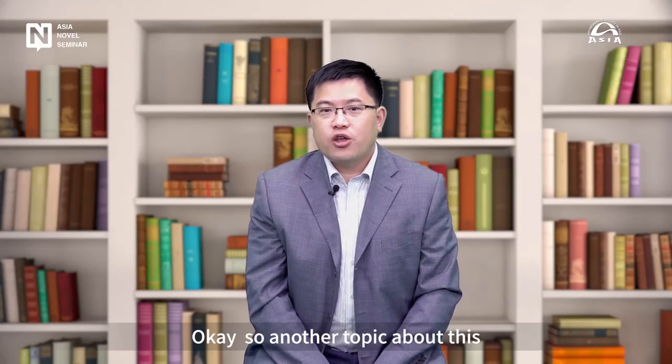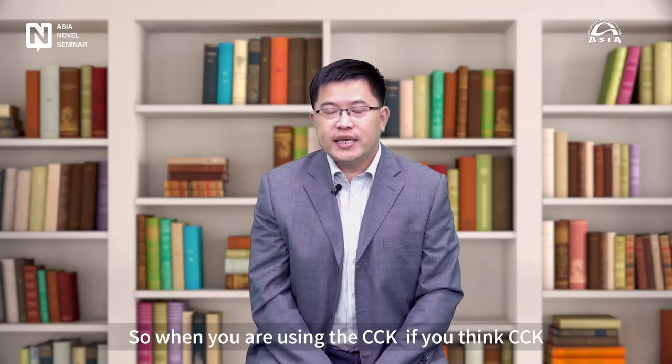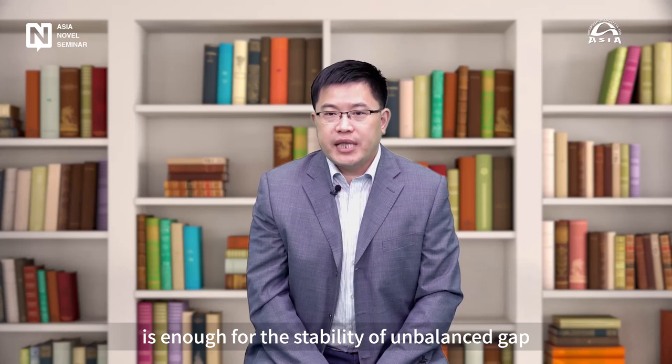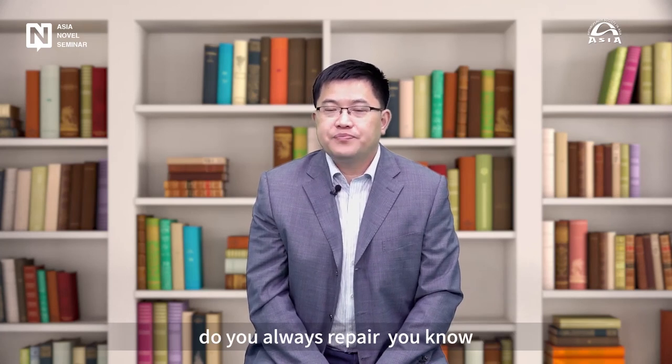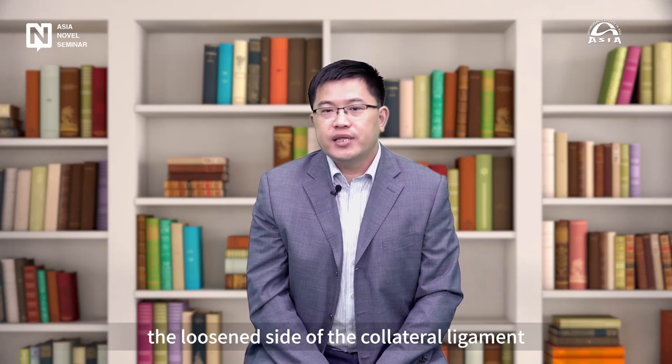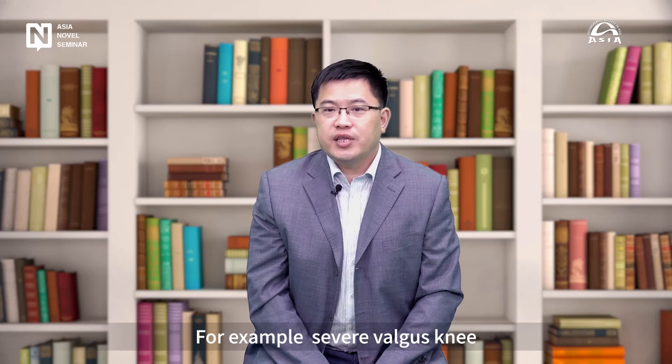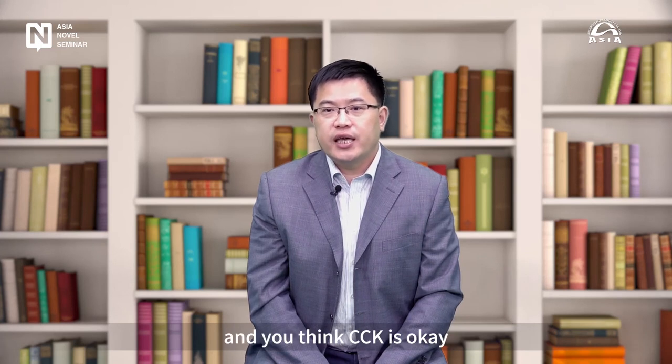Okay, so another topic about this. When you are using a CCK, if you think a CCK is enough for the stability of unbalanced gap, do you always repair the loosened side of the collateral ligament? For example, severe valgus knee, and you think CCK is okay. Would you like to strengthen the MCL?